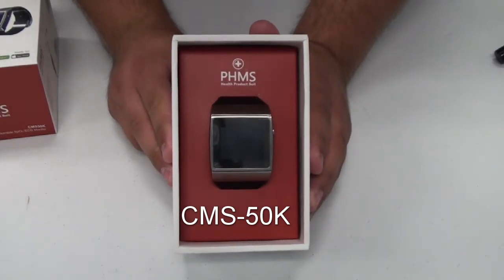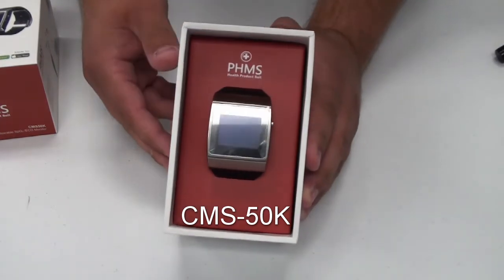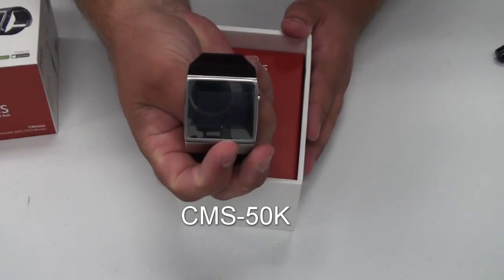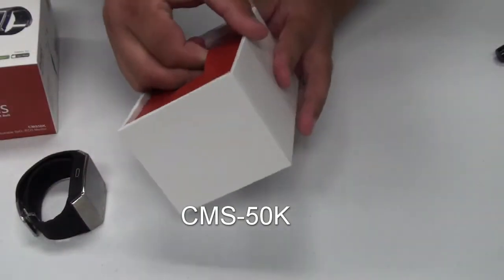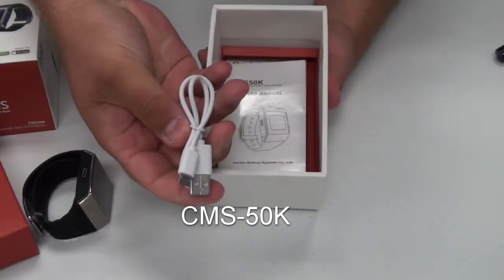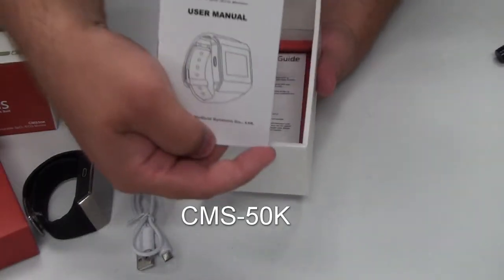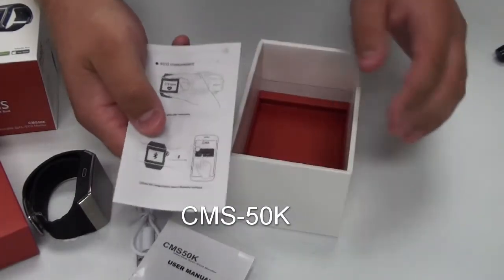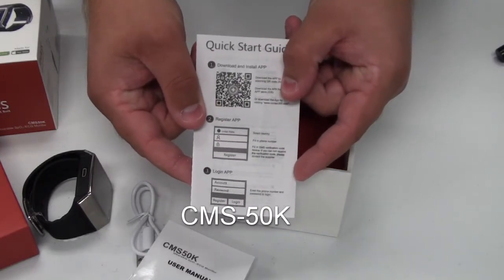Welcome to the unboxing of the CMS50K Wrist Pulse Oximeter. This device comes with the wrist oximeter itself, and underneath the packaging it also comes with a recharge cable, an instruction manual, and a step-by-step guide to how to set up the application for the CMS50K.